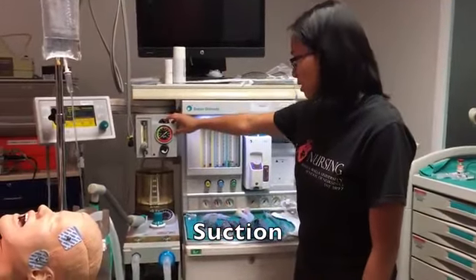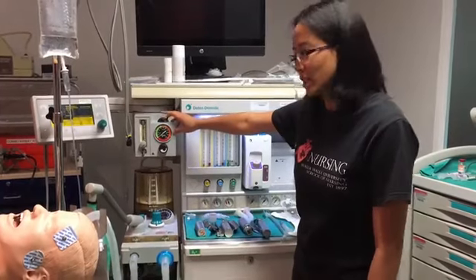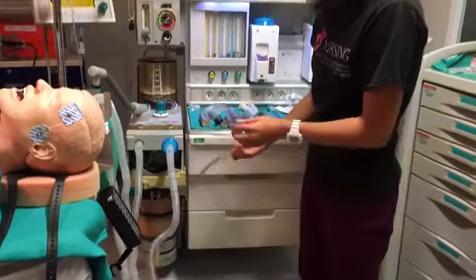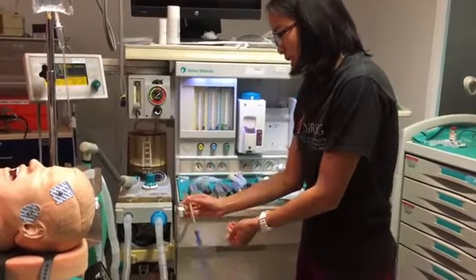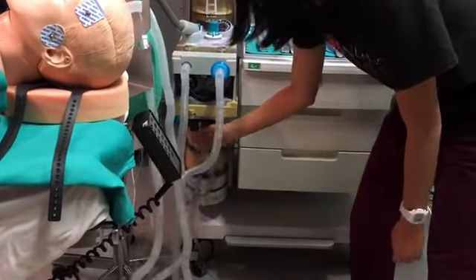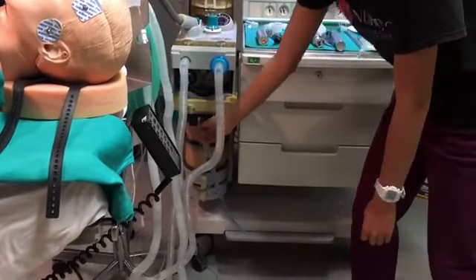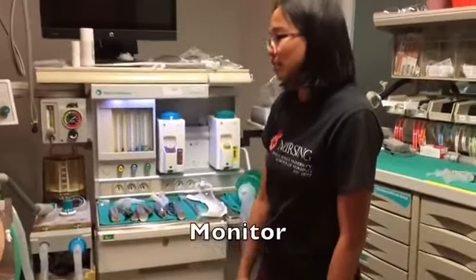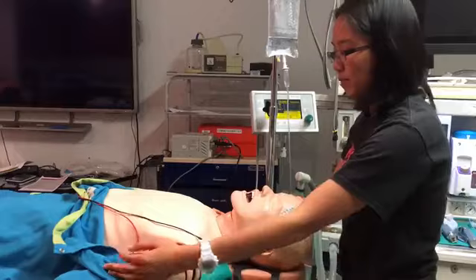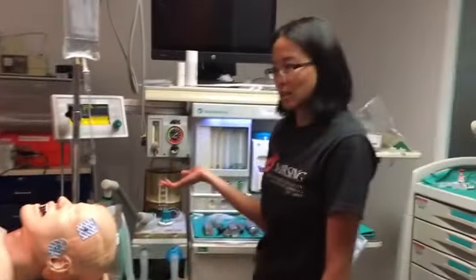Always want to make sure that's on. No suction, no induction is a rhyme that one of the teachers said. We have a suction tube in here. Usually you just kink it and put it in a spot. Always know where your suction is. That's really important for the preparation in the room. Next, M is monitors. You want to make sure EKG leads are present, blood pressure cuff, SpO2, etc.